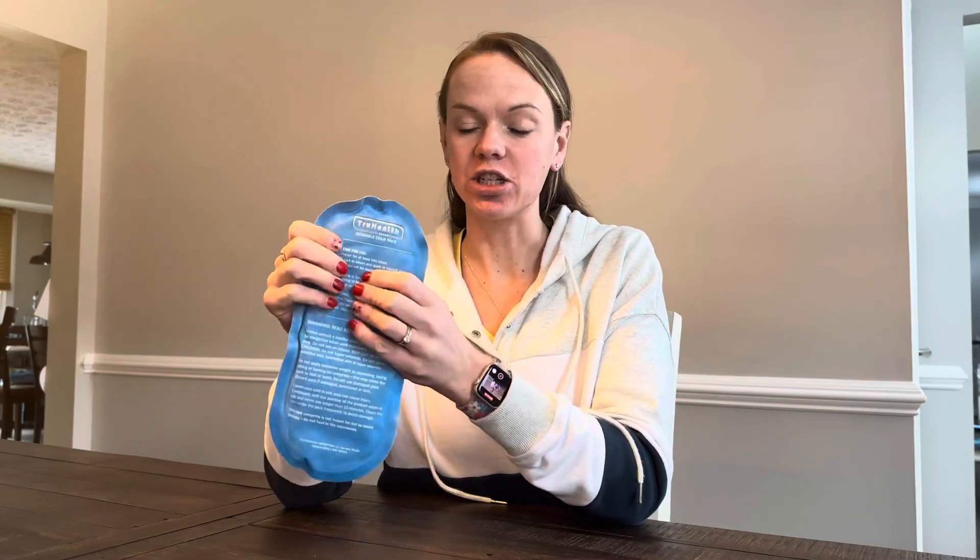Hi, I want to tell you about these True Health Reusable Gel Ice Packs. I've been using these for like three years. I really like them because they're the gel, so you can kind of just massage them a little bit and get them to mold exactly to whatever extremity or wherever you have your injury.